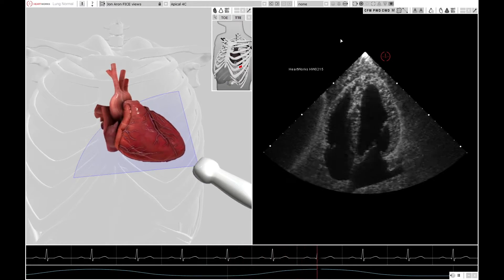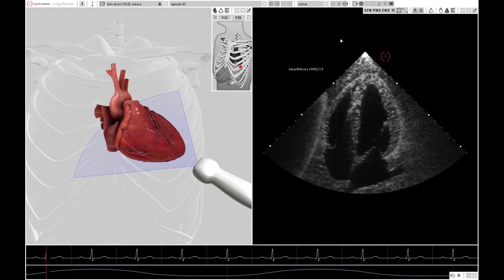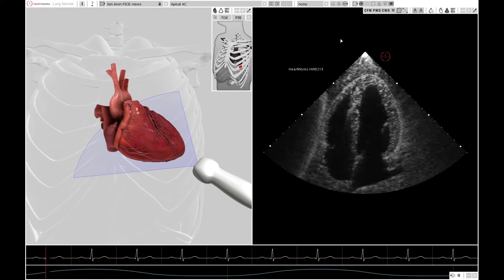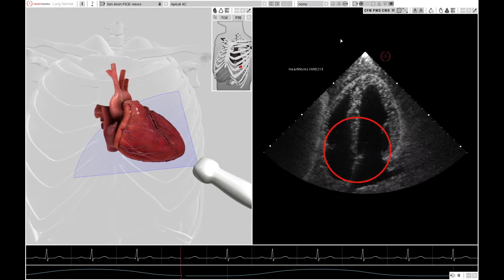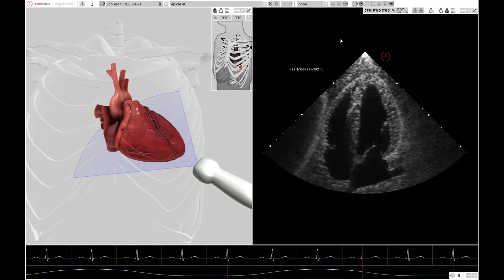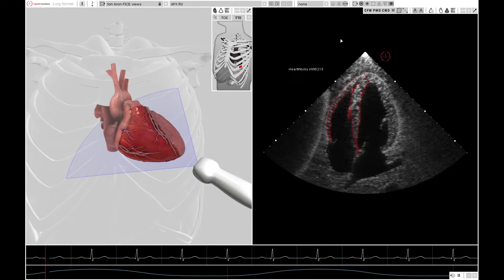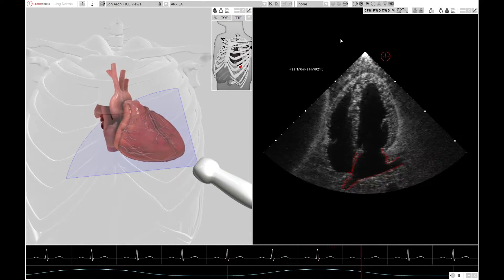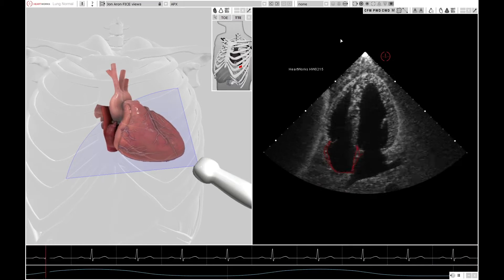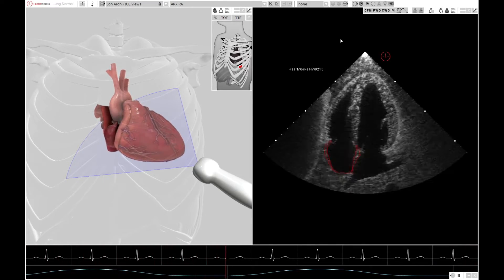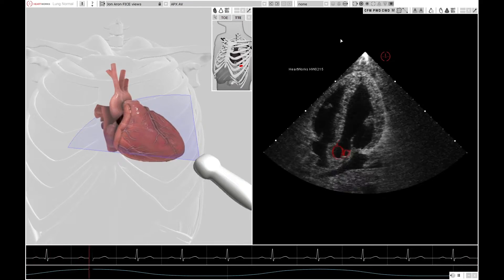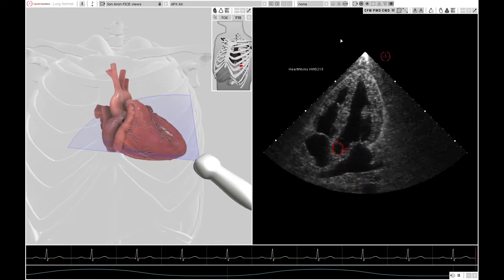The next window is the apical window. You slide the probe until you find a gap between the ribs around where the apex is and produce the image as shown. You often have to increase the depth and ensure that both mitral and tricuspid valves are visible so you can accurately assess chamber size. The structures you can see are the right ventricle, left ventricle, mitral valve, tricuspid valve, left atrium, and right atrium. If you tilt the probe more anteriorly, you open up the left ventricular outflow tract and the aortic valve — this is not a FICE view, and you tilt the probe inferiorly to get back to the four-chamber view.